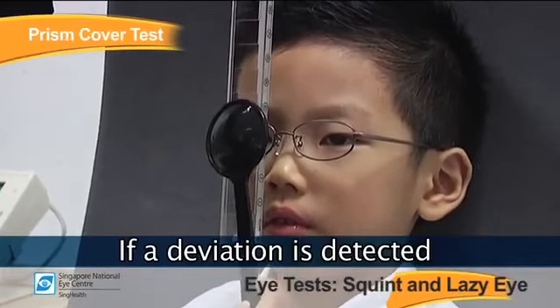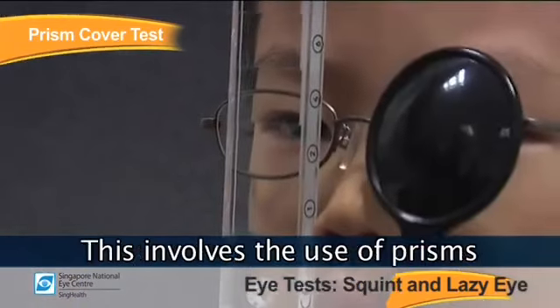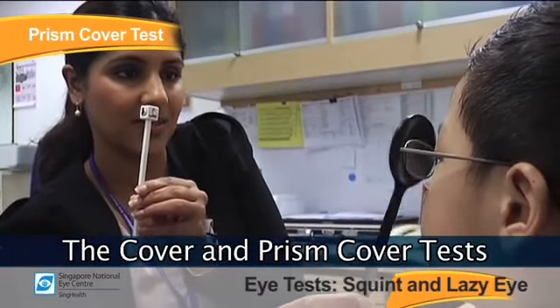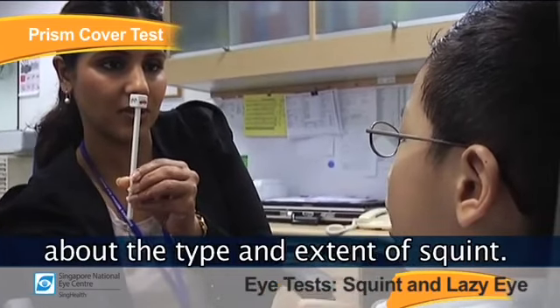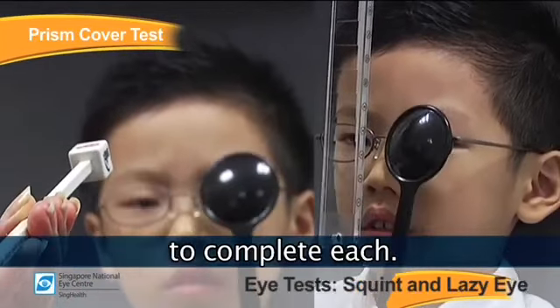If a deviation is detected on the cover test, it can be measured using the prism cover test. This involves the use of prisms to measure how much the eye is turning. The cover and prism cover test provides important information about the type and extent of squint. The cover and prism cover test usually take about 10 minutes to complete respectively.